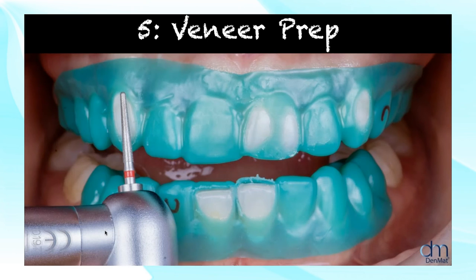Next is going to be the veneer prep. Very minimally invasive. We only work on enamel in these cases. Some cases, I understand you're not going to be just working on enamel because they're going to be a little bit more invasive, but they're always going to be as minimally invasive as possible. You can see that the facial reduction was very, very minimal in all of these cases. So that's something that you want to show the patient.